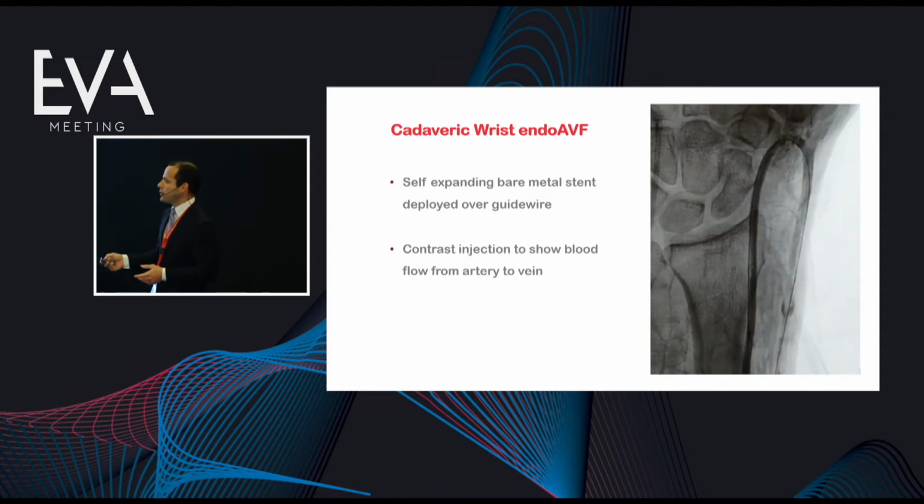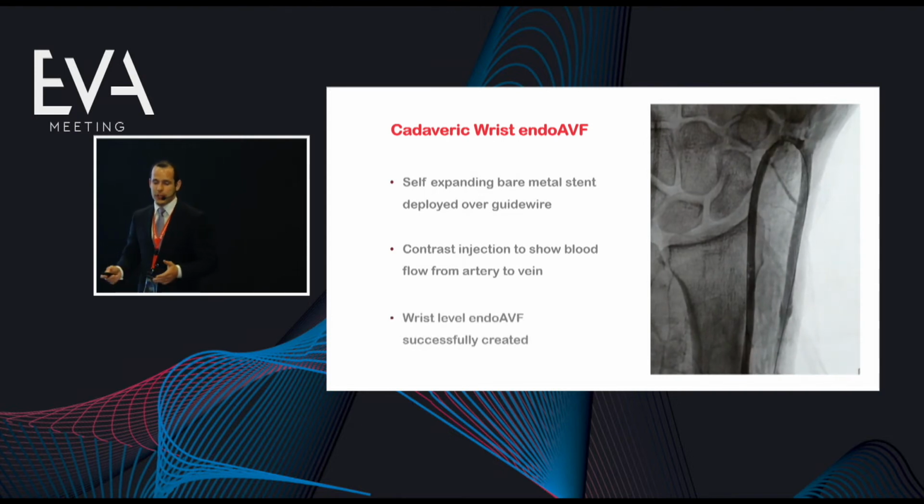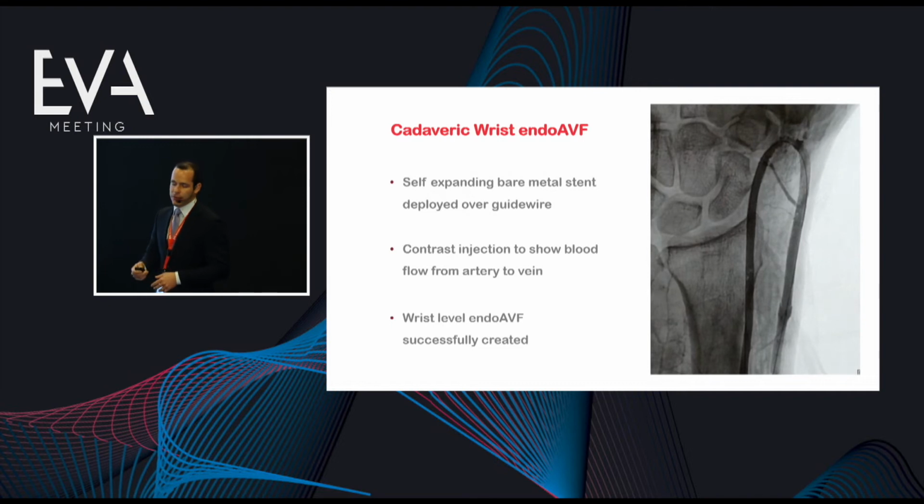Of course, the flow is not great because it's a cadaver, so it still has some limitations. Of course, the fistula then stayed patent all the time that we injected, so it was like consistent flow with no extravasation at the final angio.